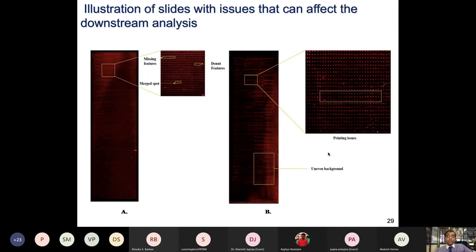And when you do the immune response screening, again, sometimes you find, in this case, probably the patient serum was too much concentrated. Dilution was not appropriate, too much background, we can see it here. So these regions may not be good actually to take forward. So you need to optimize this slide. Either this could be an array problem or this could be a serum concentration problem. You have to actually avoid these background issues, right?